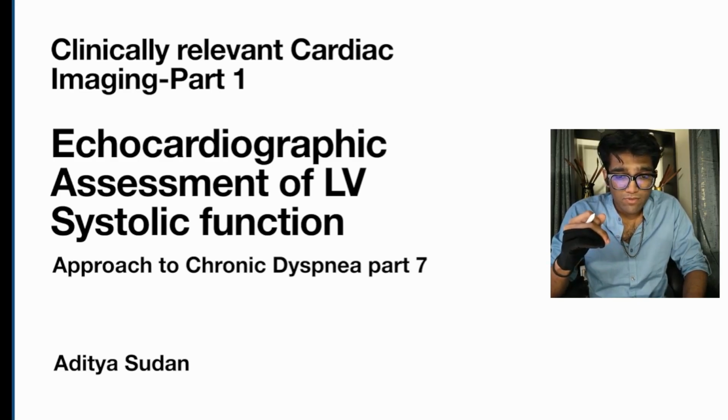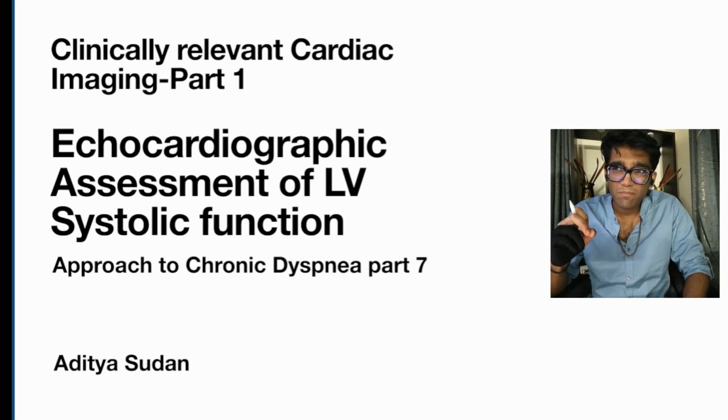And from the point of view of an internal medicine doctor or a person who does not specialize in cardiology per se, the interpretation of an echocardiogram can provide vital information to differentiate the different causes of shortness of breath in a person with a multi-system disease, say rheumatoid arthritis, systemic sclerosis, a multi-system infection. Okay, so it is important for the non-cardiologist as well.